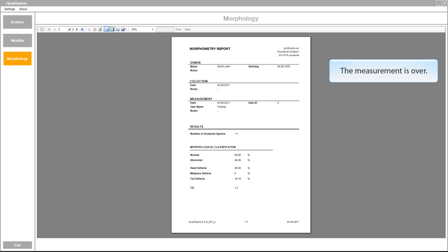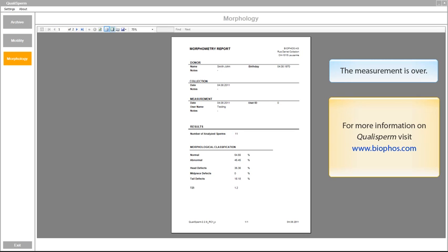Within a few minutes the entire analysis is completed and Qualisperm generates a report which you could print, save or email.